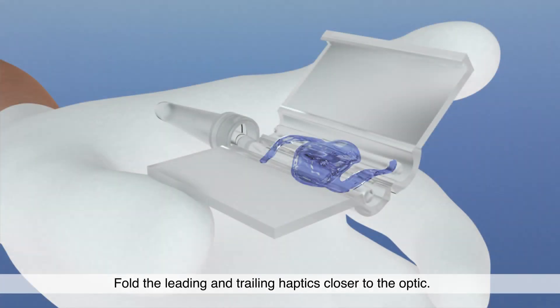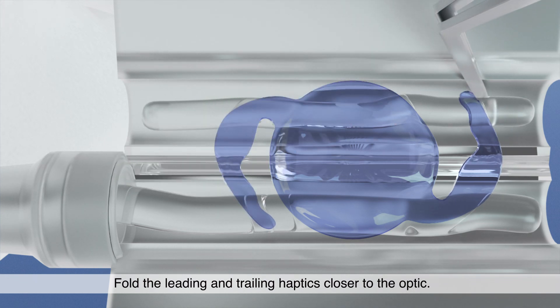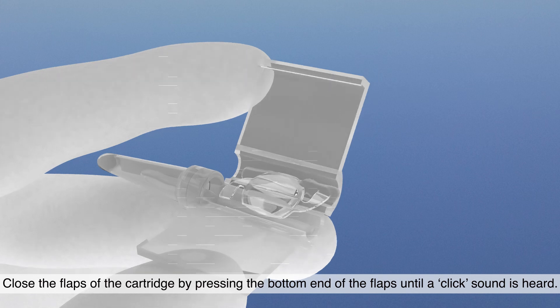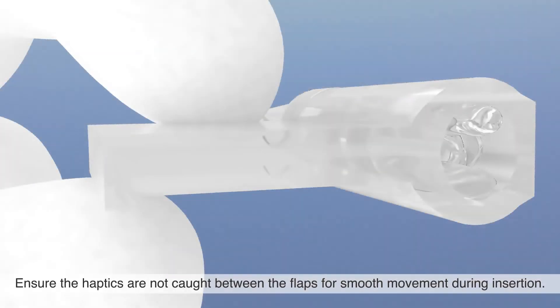Fold the leading and trailing haptics closer to the optic. Close the flaps of the cartridge by pressing the bottom end of the flaps until a click sound is heard. Ensure the haptics are not caught between the flaps for smooth movement during insertion.